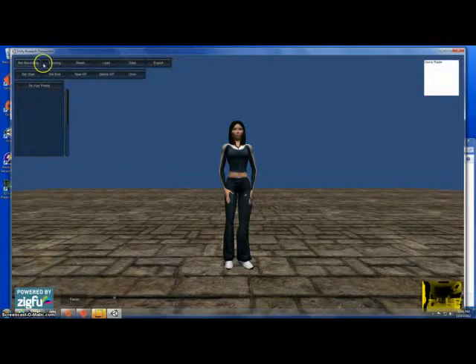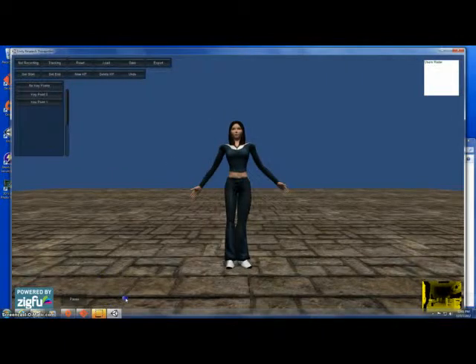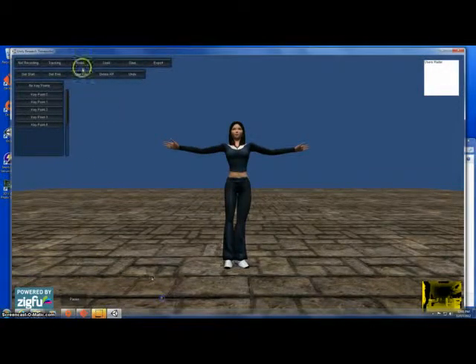Key points are important aspects of the movements that define the exercise and describe the pose so that a patient will be able to understand what is expected of them. Once again, the therapist may navigate through the motions using either the play-pause button or the scroll bar. When ready, he or she can add the key point. Key points can be added or deleted, and there's no limit to how many key points can be created.